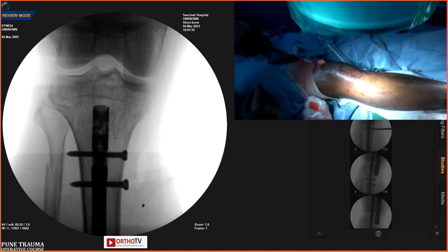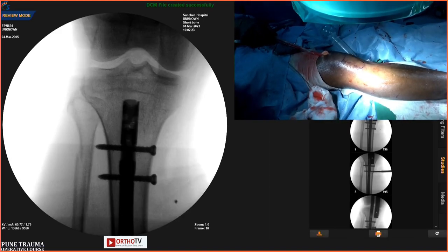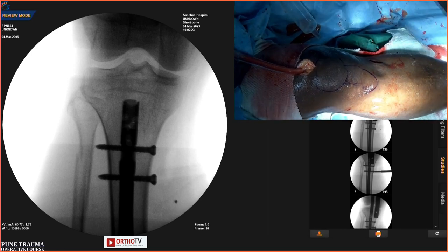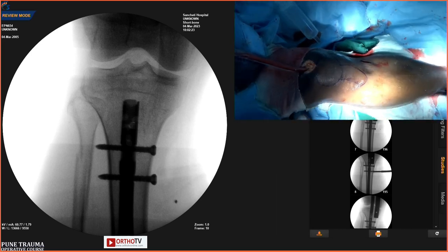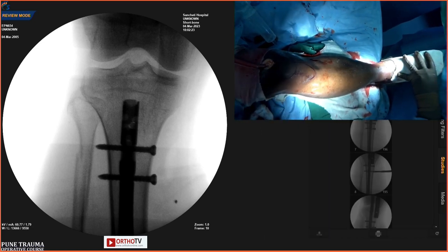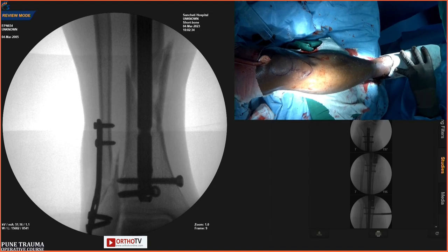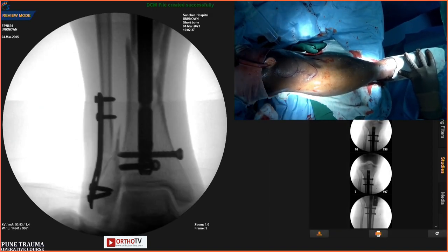Shoot. Can you see that? Is it okay? Perfect. Come down. You see the distal? Now see the distal. You see, we are worried about the ankle plafond. You can see it's horizontal.